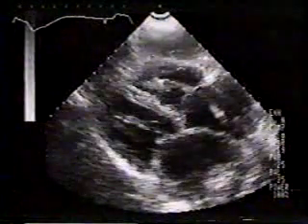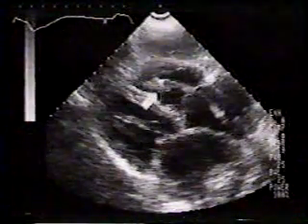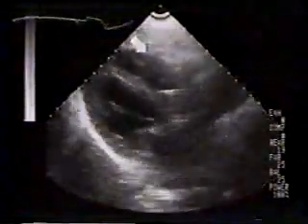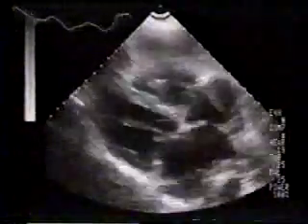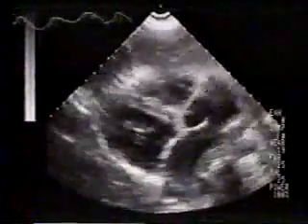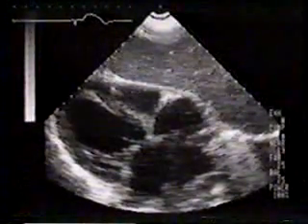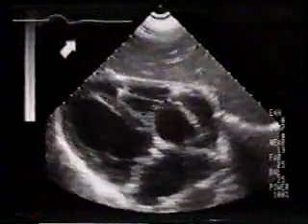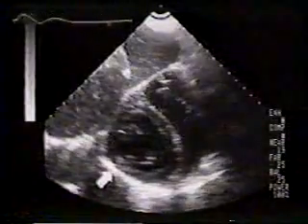This image is in 4-chamber format. This is the temporary pacemaker in the right ventricle. This motion of the image is due to chest compressions, which had been resumed. Note that subcostal imaging does not interfere with the resuscitative effort. Now the compressions have been held again. The pacemaker is only capturing intermittently, but even with capture, there is no myocardial contractility. This is true electromechanical dissociation.